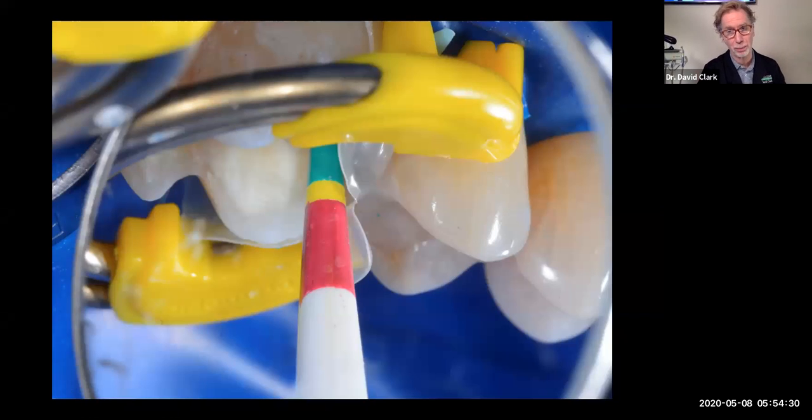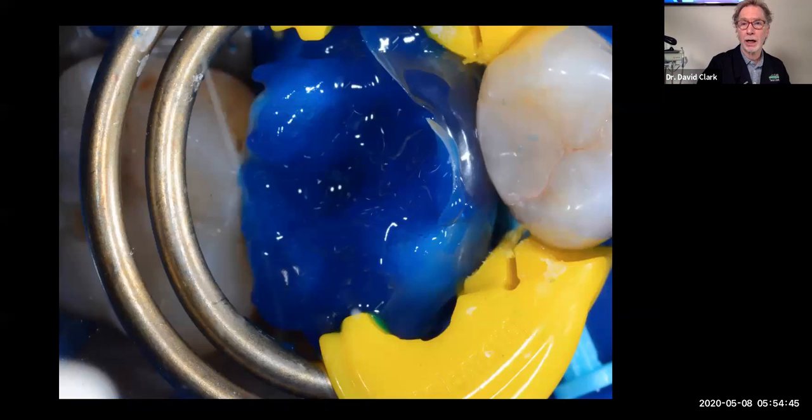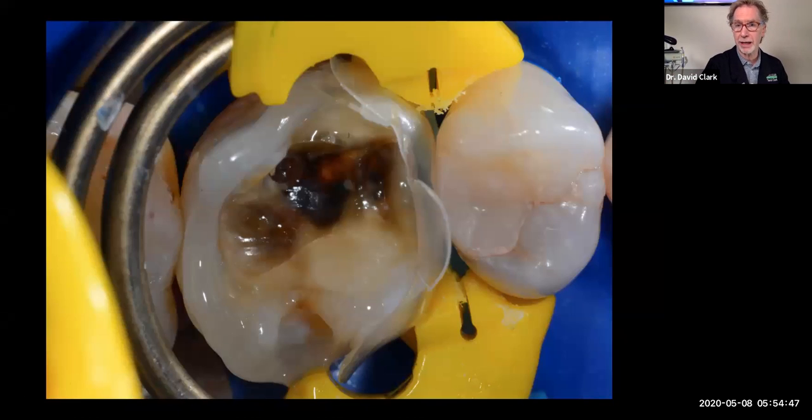So you can use a periodontal probe. We like the go, no go probe, so let's make sure that the schools have this when you're using biofit, so we know what 5 millimeters is. So in this case, we don't have to layer on the interproximal, although we're kind of borderline here. So we're going to go ahead and etch to the edge of the matrix.